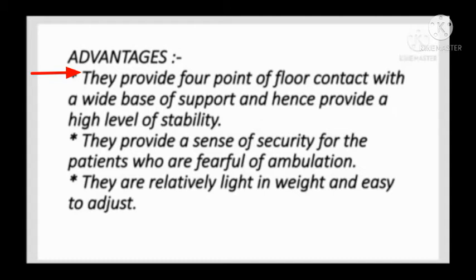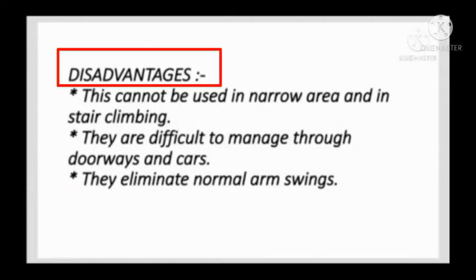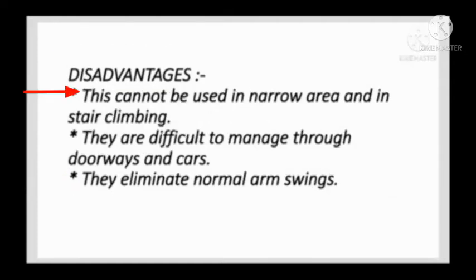Advantages: they provide four points of floor contact with a wide base of support and hence provide a high level of stability. They provide a sense of security for patients who are fearful of ambulation. They are relatively light in weight and easy to adjust. Disadvantages: this cannot be used in narrow areas and in stair climbing. They are difficult to manage through doorways and cars. They eliminate normal arm swings.